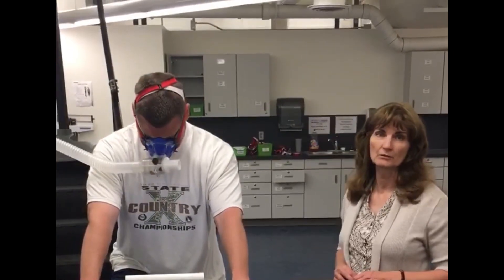We're here at BYU Iron Home Exercise Physiology Lab today to do a VO2 max test. Just remember that if you're used to doing the bicycle, then it is your max test. But if you usually run, then you probably want to do the treadmill test instead.